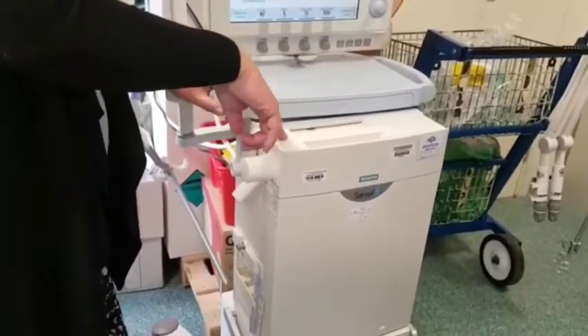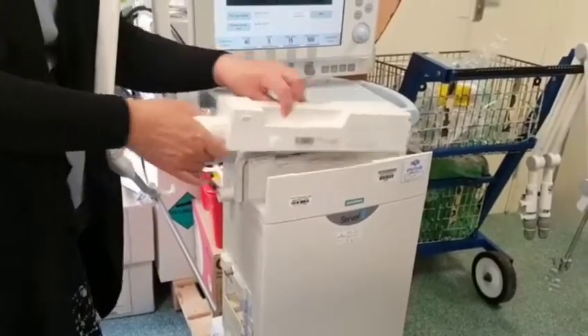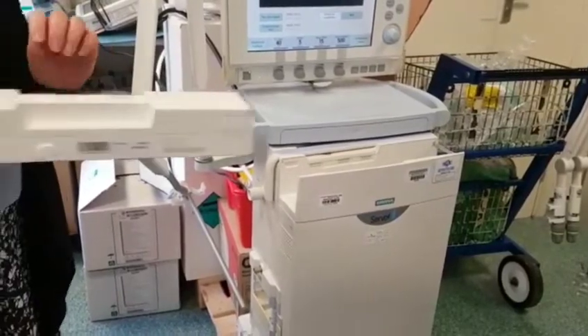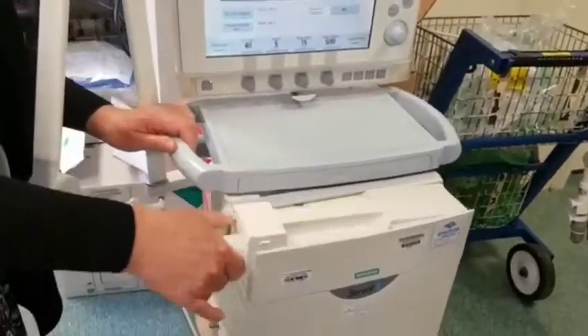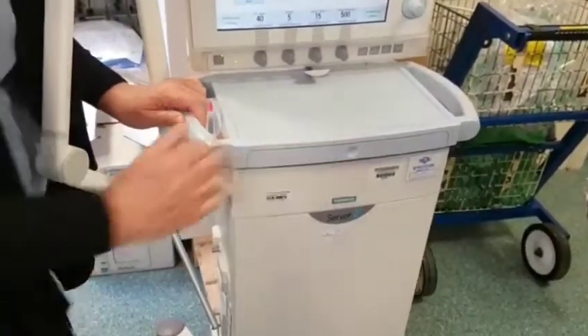Just like the Servo U, you have to depress the button to release, lift out, take away, send to CSSD, get a new one, slide into position, and push down. Then you can push the patient part back.